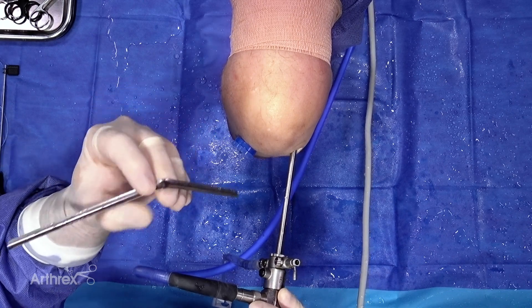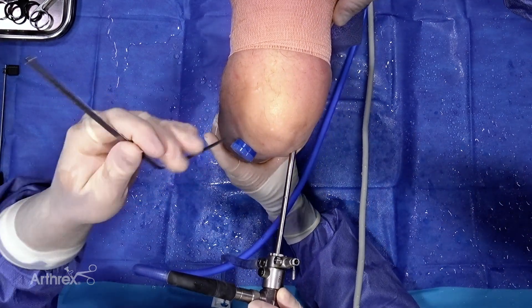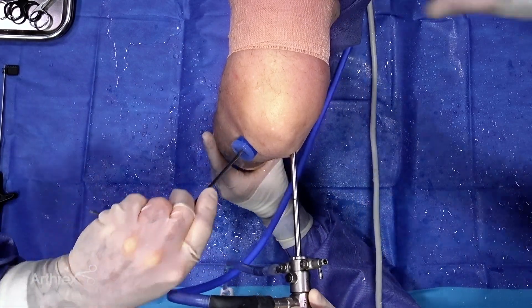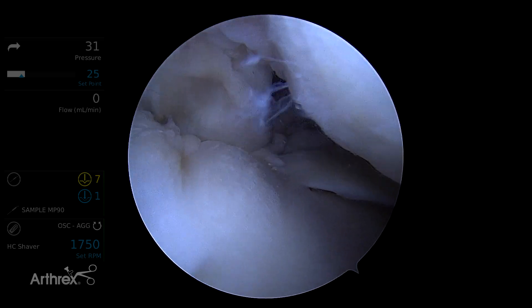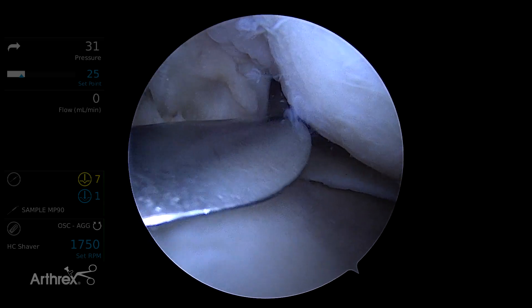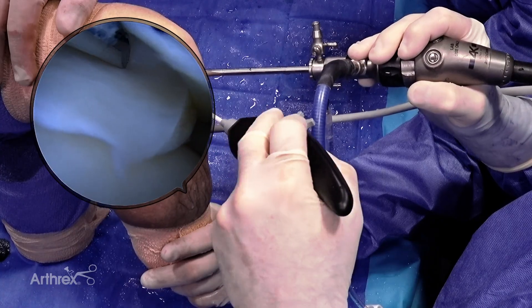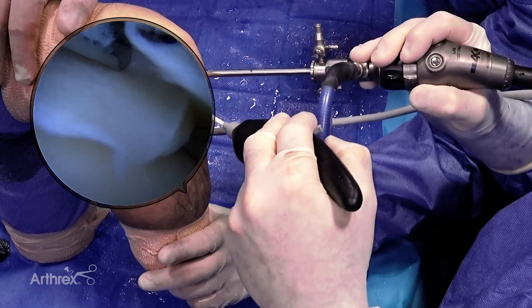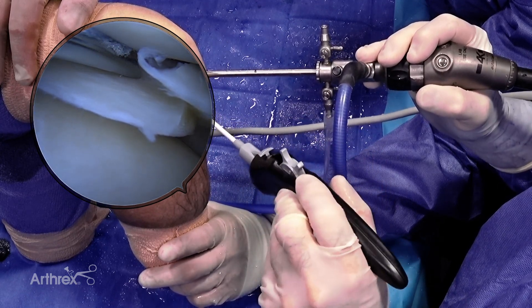We're going to use a flexible portal skid. It's got a thinner end — we've bent our short end — and a long end. We're going to use the long end just to guide us in. This is a way to diminish the iatrogenic injury we could create with that sharp-tip device. We're going to park it in here just to deliver the needle. We want to get offset a little bit, not too much — this is the art of it. You could be too close to it and the ripstop's not going to work.